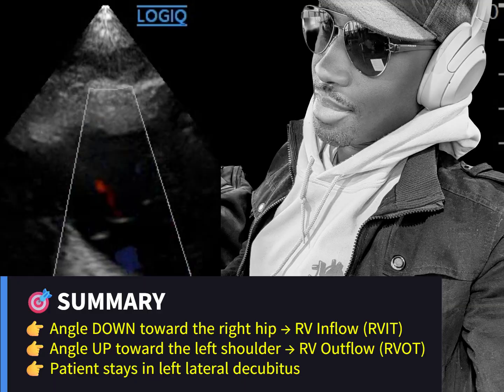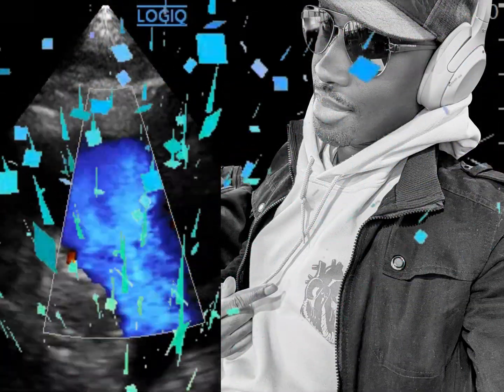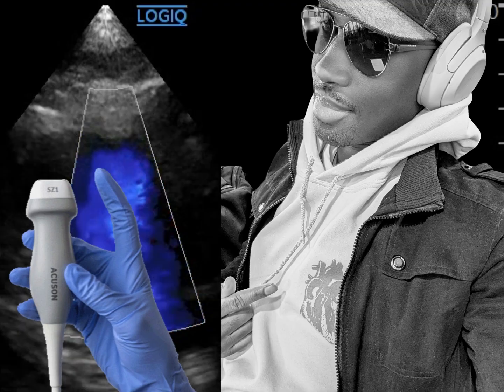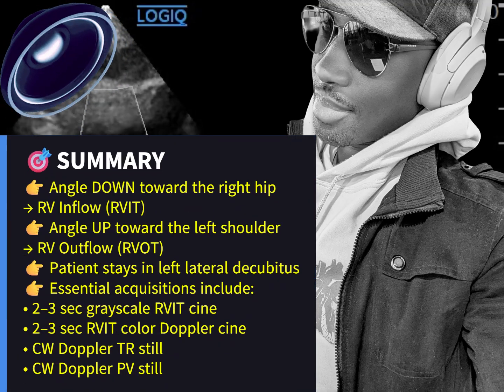Finally, let's tie this all together. First, congratulations. You've just learned two of the most essential views in the right-sided echo assessment, and you did it without moving the probe even once. Remember, angle down towards the right hip to get your RV inflow or your RVIT view. Angle up towards the left shoulder to get your RV outflow or RVOT view.